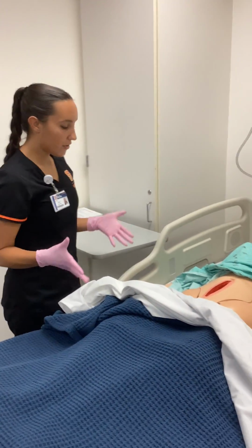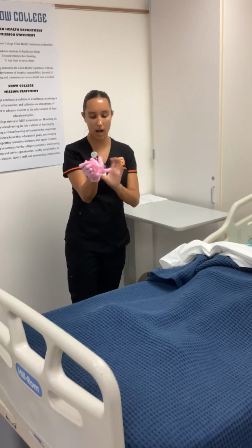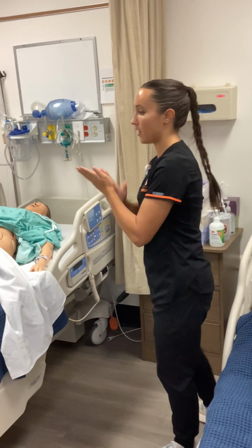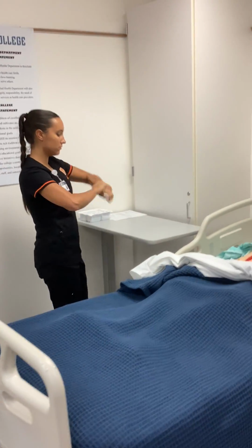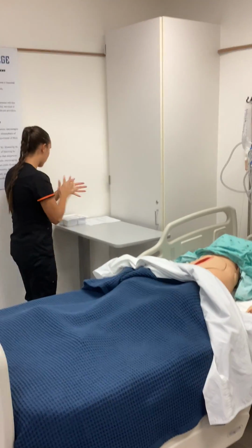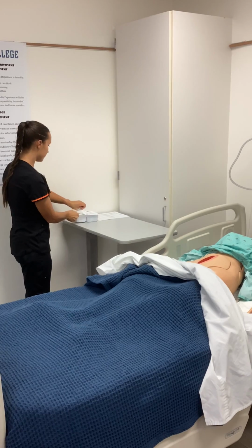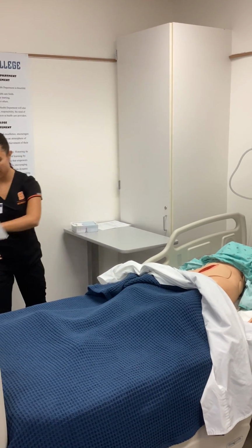Now that we've looked at all of this, it is time to clean. So I'm going to take these gloves off, and I do need to wash my hands, so I'm going to hand sanitize. And I'm going to set up my sterile field now. Okay, so now I'm going to take my supplies and open it away from me, and I'm going to throw that away.